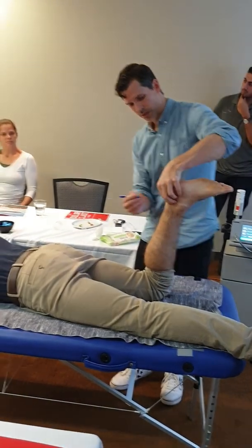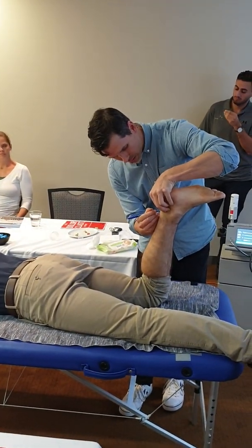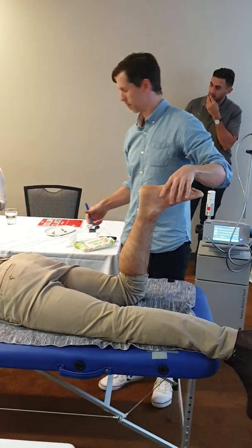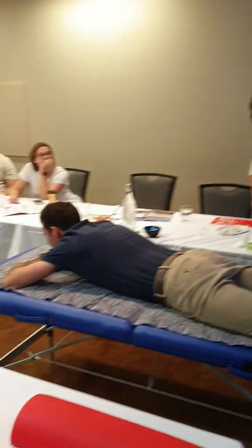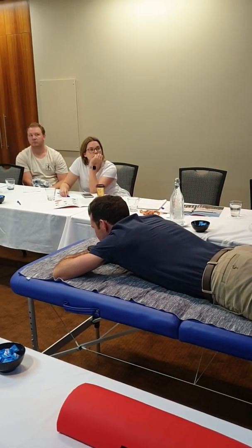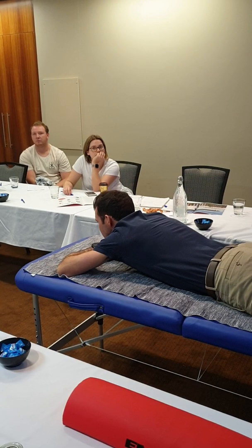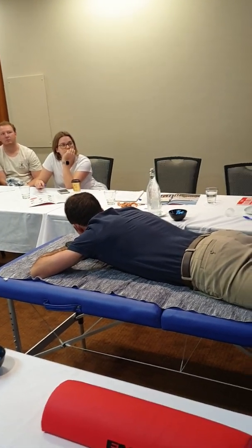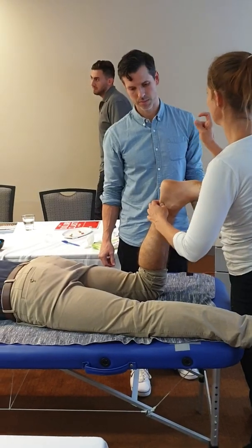And have you had it treated with shockwave? No, I haven't. Yeah. Me too scared. So what have you tried? I had needling on it, exercise, osteo. Do you want to get everyone to sort of feel so we can? Okay, so you've done all your heel lift stuff, your hanging hand, all your loading.